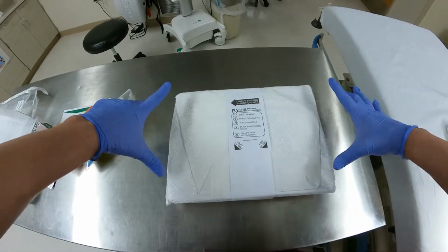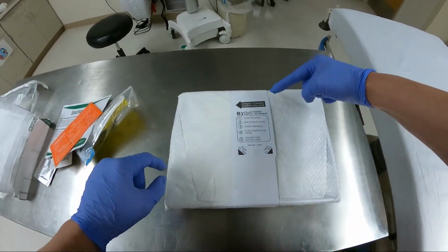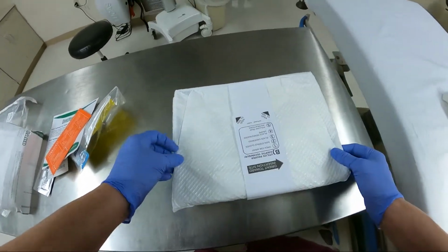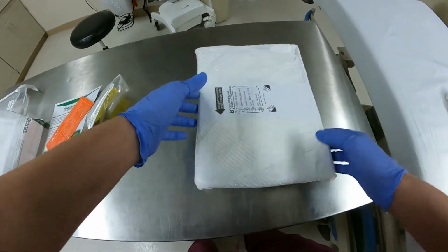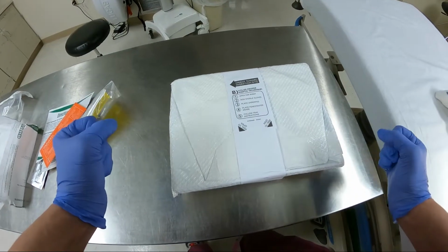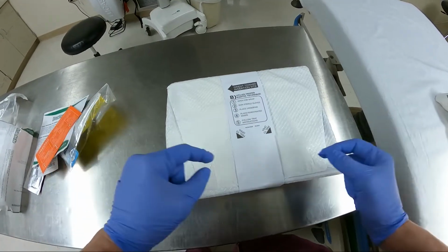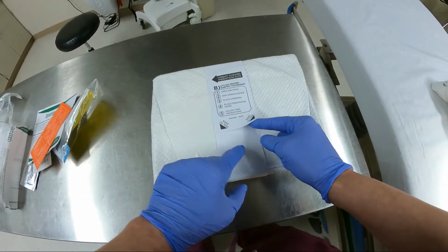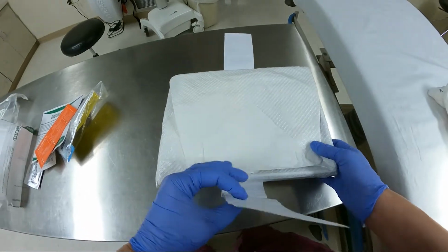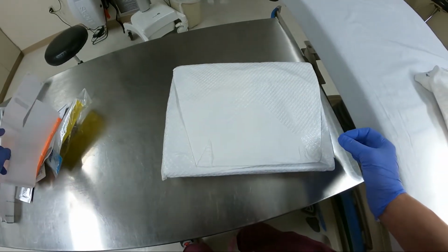Now, it tells you what to do here. Orient towards the insertion site. So in this case, our insertion site is over there. I can put a catheter in right-handed or left-handed, because I learned wrong and discovered when I learned right that I can do either right-hand or left-hand, which comes in handy. You need to be on the side that is your strong side.